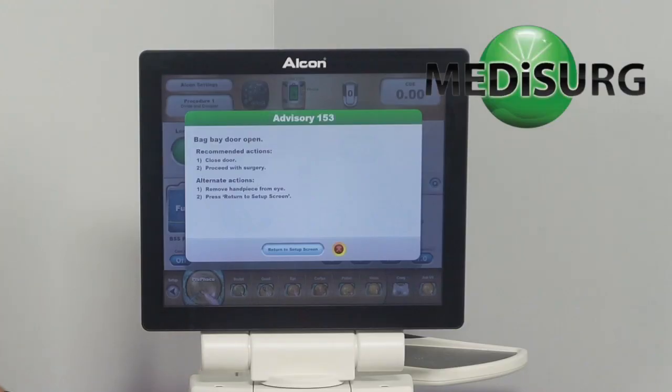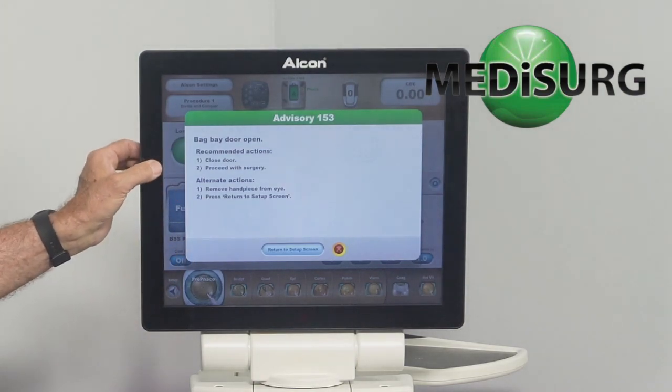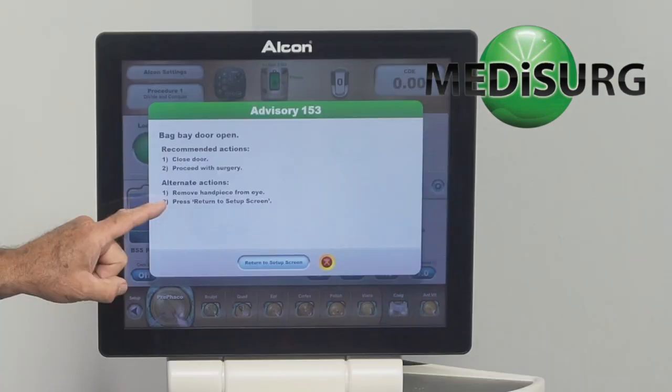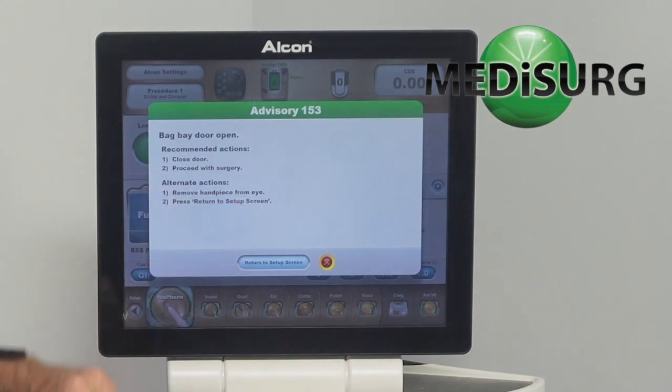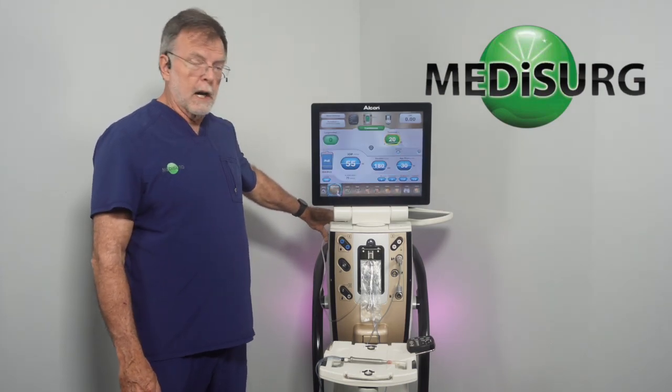The door opens, and 153 shows up on the screen. It says the recommended action is to close the door and proceed with surgery. The alternative action it requests is to remove the handpiece from the eye and press Return to Setup Screen. If you close the door, everything's fine.